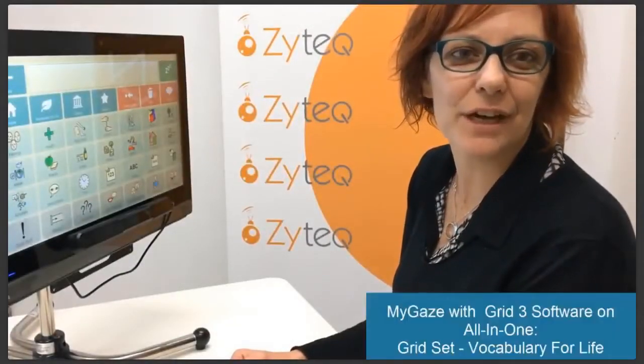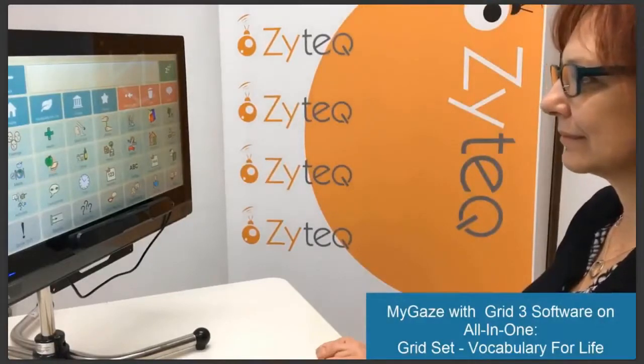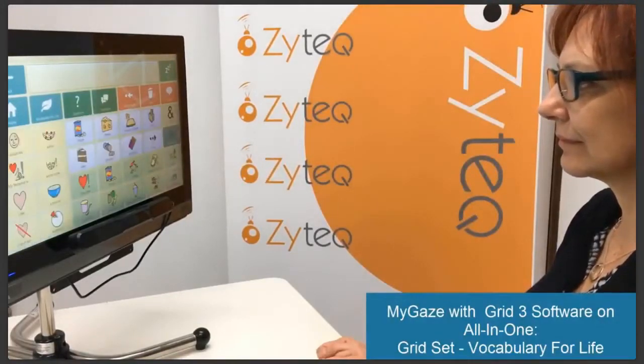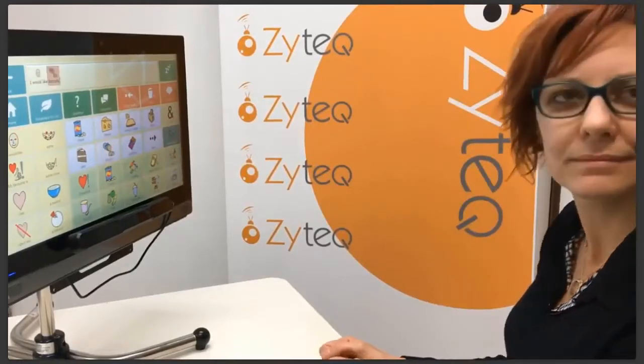This is Grid 3, Vocabulary for Life. I would like biscuits.